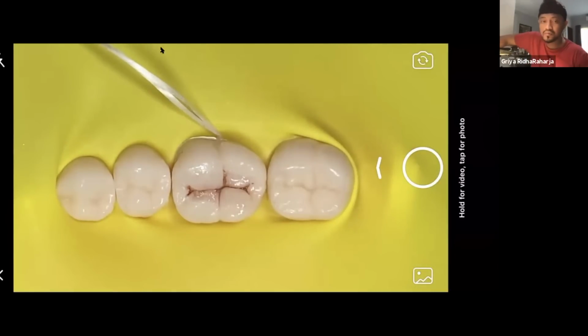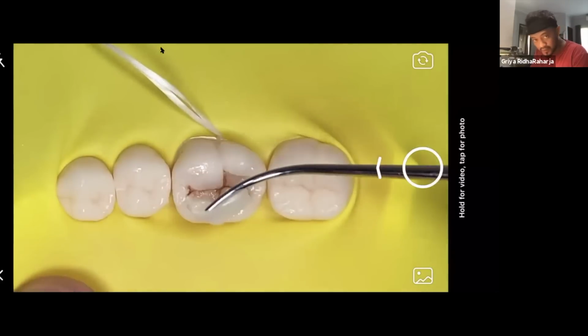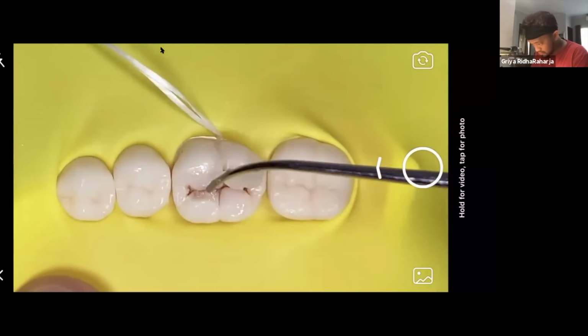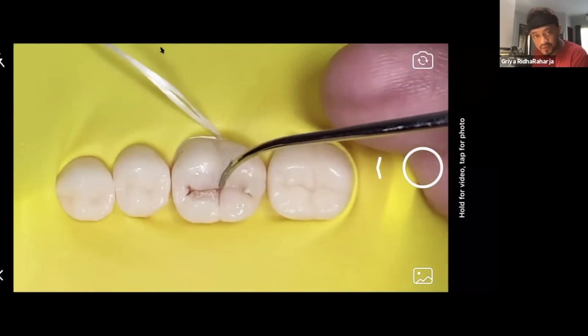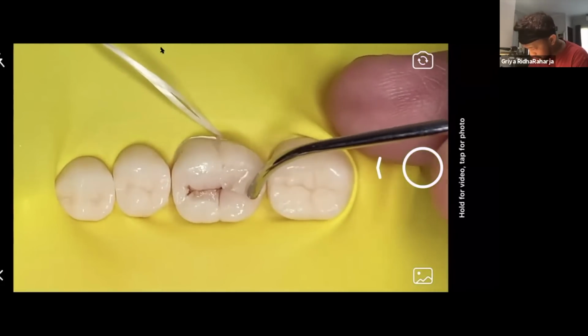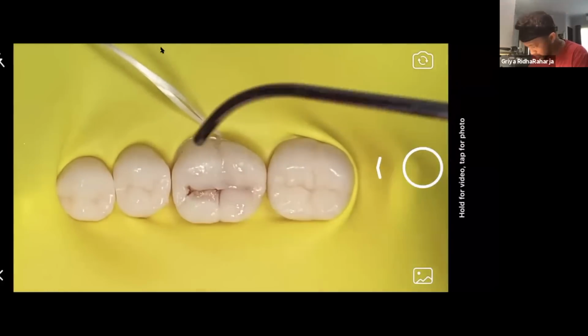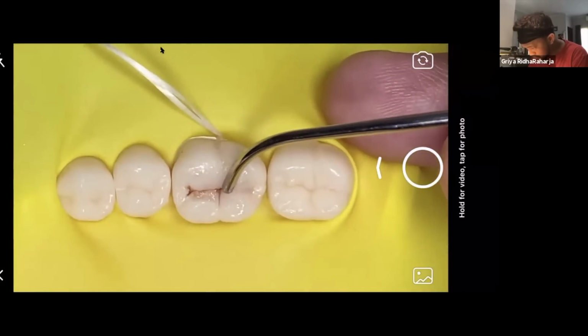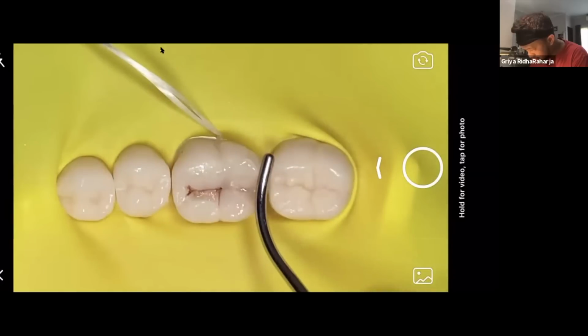Okay, let's go here. And now let's do the side. These sides, same with enamel. Just push again, push, push, push like this. Step, step, stepping. If you have excess, remove. Remove this too. See, so big. It's okay. We need to adapt it well. Stabbing, stabbing like this. And then remove again. See?